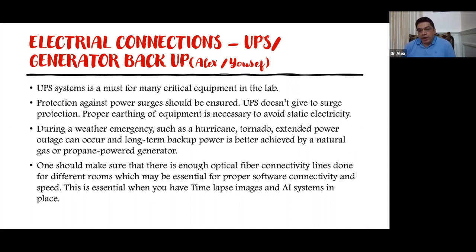The incubator was showing the 6% or whatever set point of CO2, but when analyzed with the equipment monitor, it was found to be only 2 or 3%. That happens when a power spike occurs. It can affect your calibration of the temperature or the CO2. So that is another area you have to keep in mind. And there are many other areas that need to be considered when you are planning your electrical connections. Maybe Yusuf can add more points.